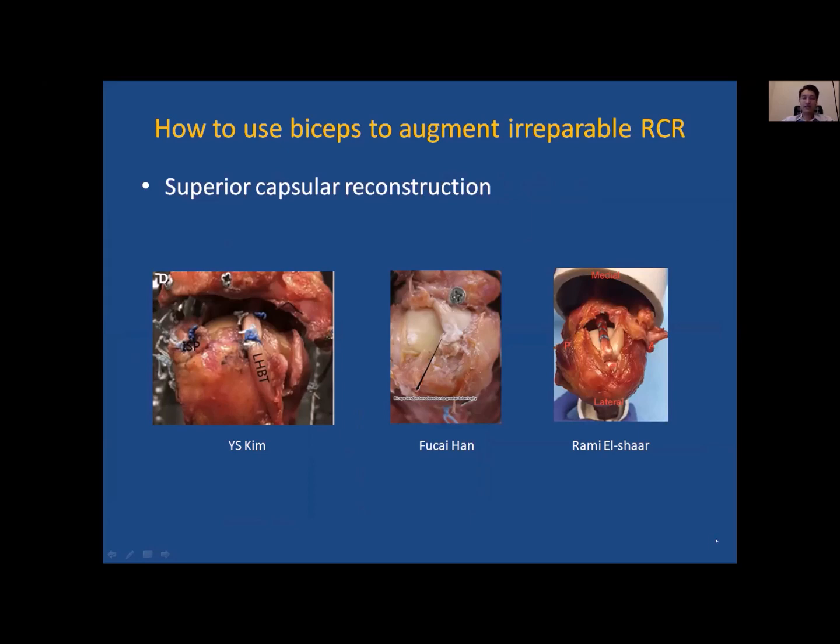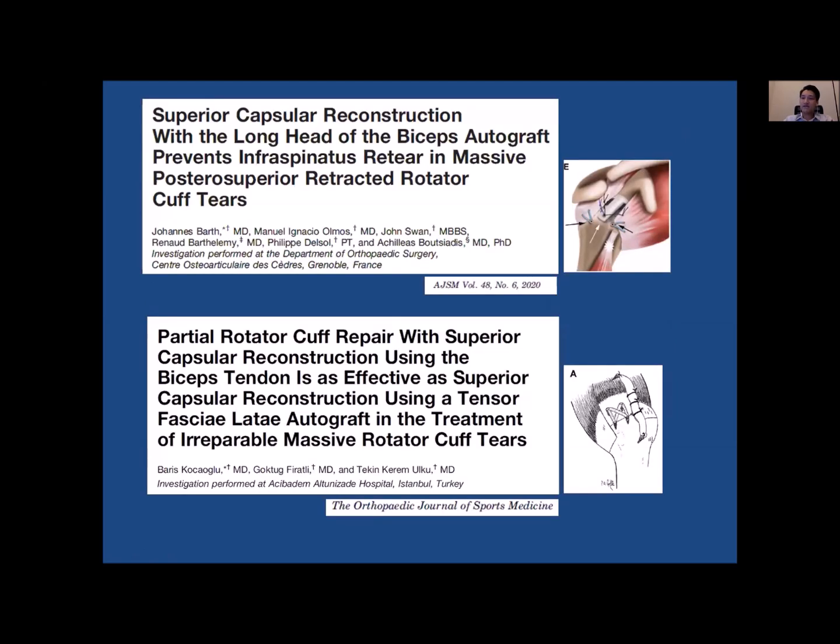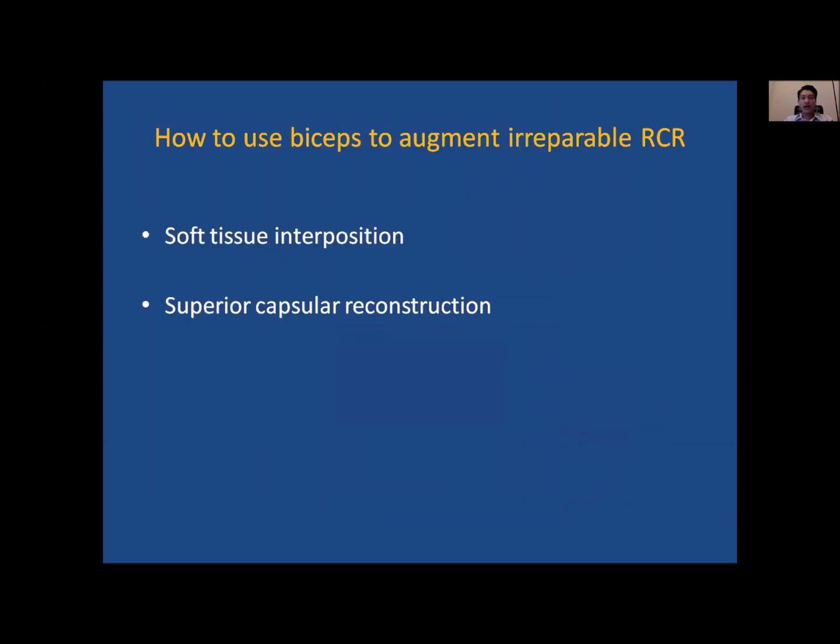Basically, we fix the biceps graft at two points, one at supraglenoid and another one at greater tuberosity, imitating the native superior capsule. As you can see, there are many options. Different surgeons have tried different procedures and have made different recommendations, but we still lack long-term clinical results. And recently, we have two clinical studies that report good results from biceps SCR. We have soft tissue interposition and we have SCR from biceps.